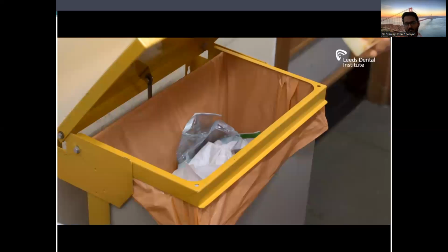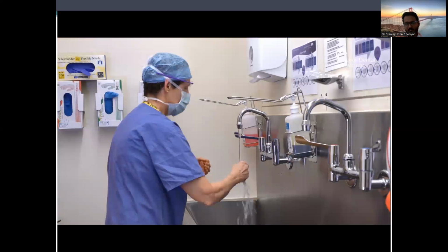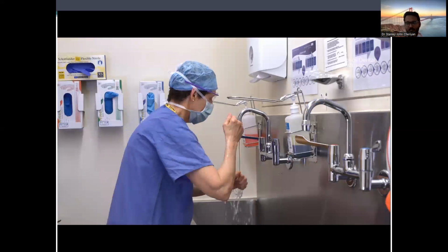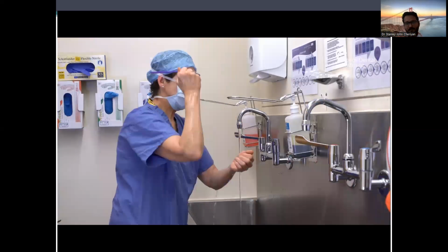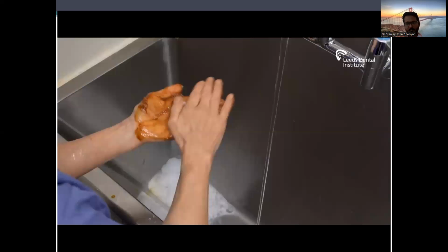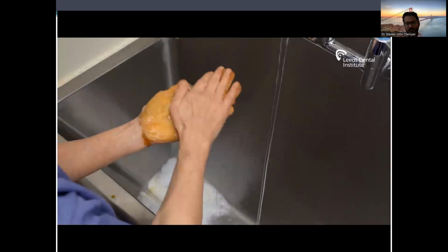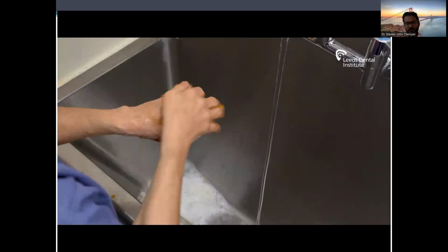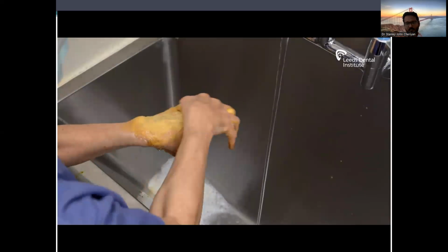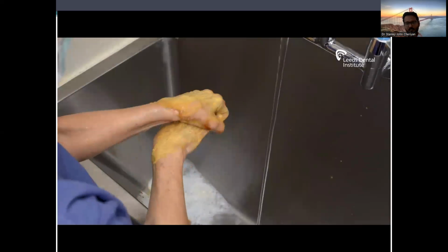Dispose of the brush, then rinse your fingertips. Apply another 5 ml of solution. Wash your hands and arms using the 7-step method, paying particular attention to palms, finger webs, and dorsum of the hands. This time, only wash the first 2/3 of the forearms and do not touch the elbows to avoid contamination. Wash for a further minute.